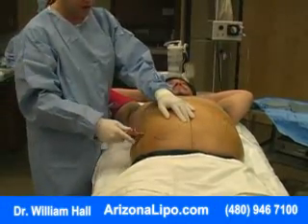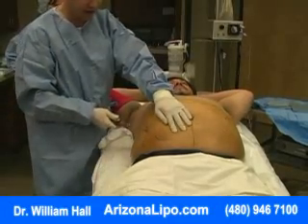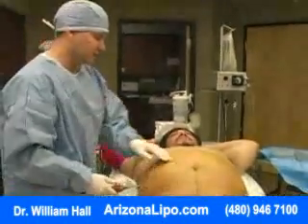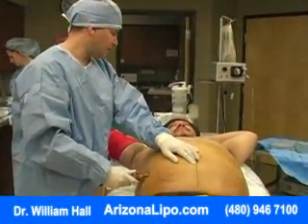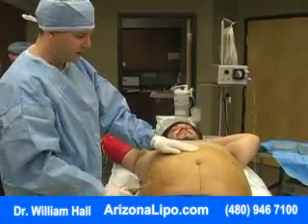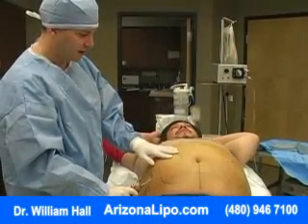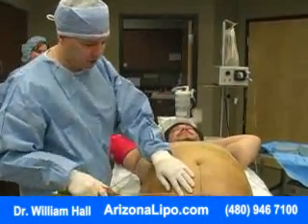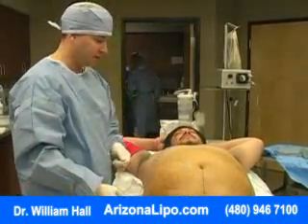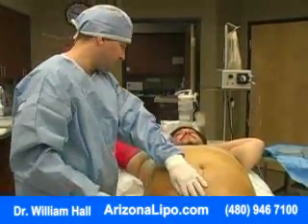Your fat is really soft. That's good because that dictates how long the suction is going to take to get the fat out. Fat has all different consistencies, and what one person your size could take you double the amount that another person takes. Is that right? There's just a lot of variation. A lot of people think that you just stick the tube in and the fat comes out pretty much the same. But there's a lot of variation from person to person. Right. And it's important how your fat comes out because that's the amount of time that we spend suctioning and working on the tissue, which directly affects your post-operative inflammation and how sore you are afterwards.